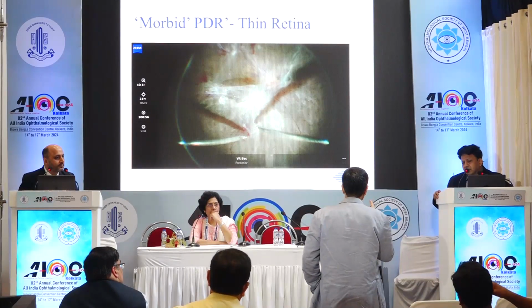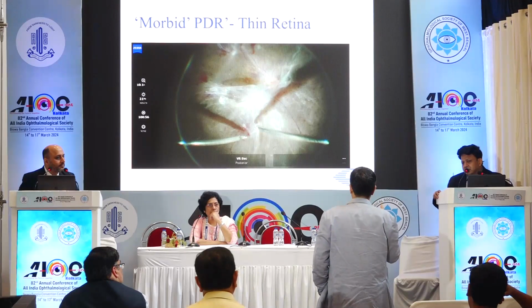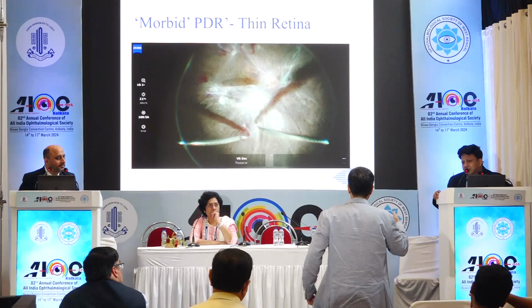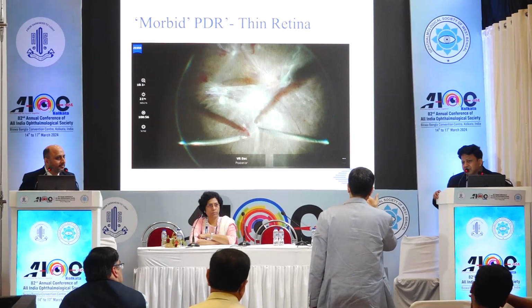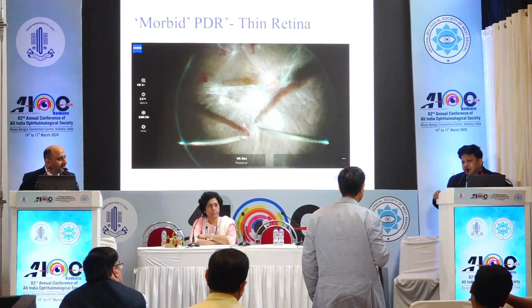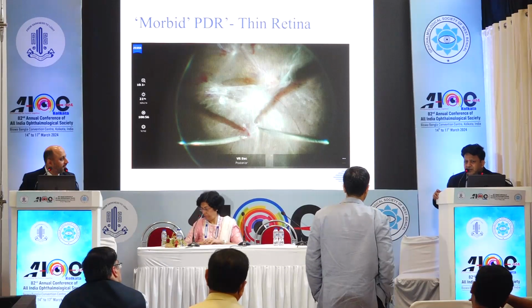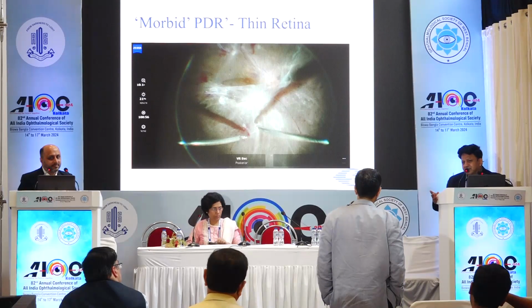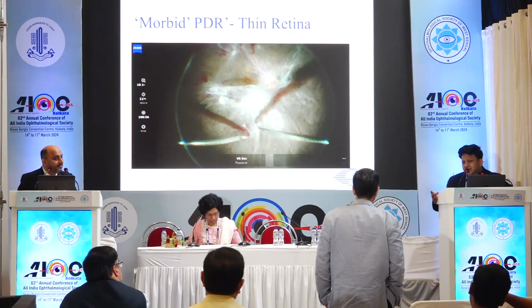And definitely, if those kind of bleedings happen, every surgery becomes a mess. Sangeet, what setting do you use? Because I think we are always worried that in detached thin retina, we are scared of using the cutter because of breaks, but you showed so beautifully that you are using only the cutter. So what are your settings and system which you are using? I generally use the 10,000 cut rate.